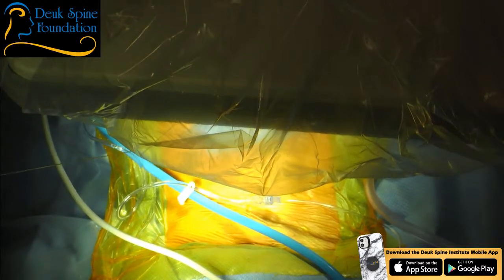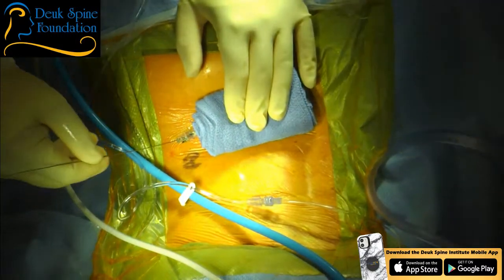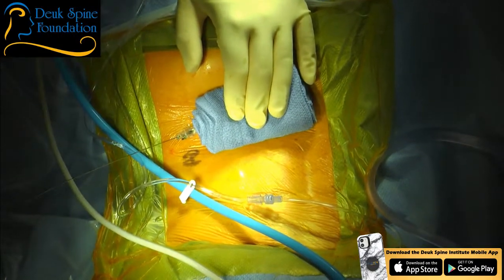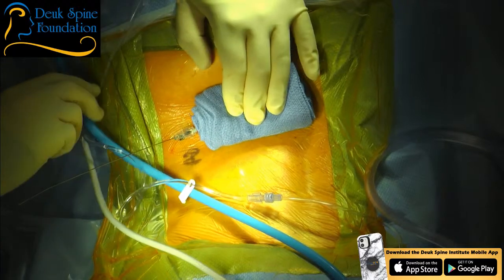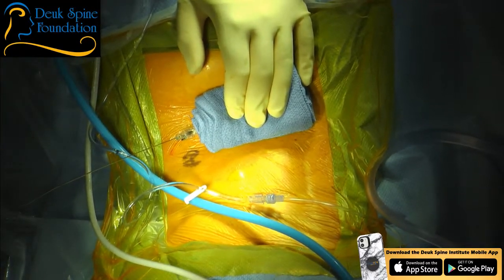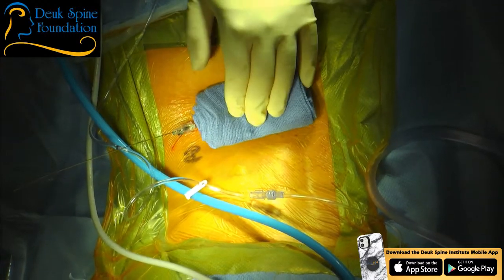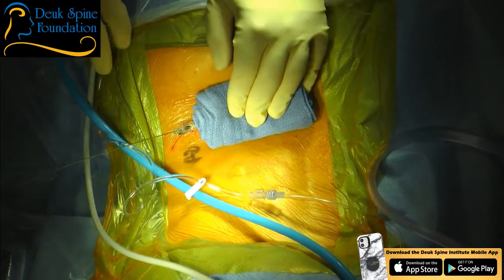Jordan, you don't need to be one-dimensional. You can be three-dimensional while you're bringing the fluoro in. I've seen x-ray techs push the base in, rolling it in as they're turning it and dropping it. It doesn't have to be this, then this, then this. It can all be done fluidly at one time. That's what you should work towards. All right.